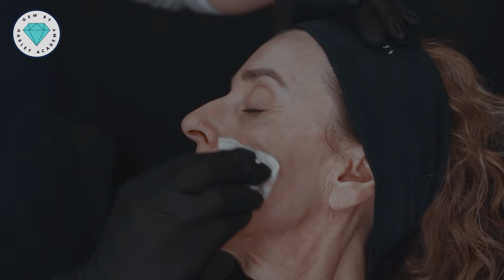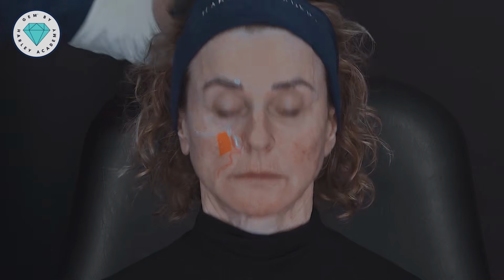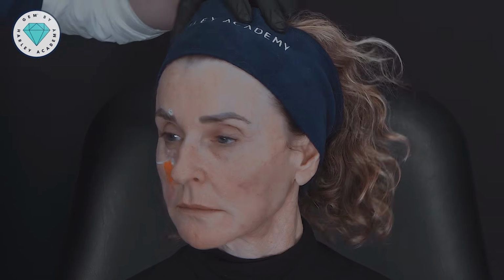Perfect. Sit forwards for us. Okay. Oh, better. And really big smile, please. You see we haven't overfilled that aspect of the cheek. Relax. Good.